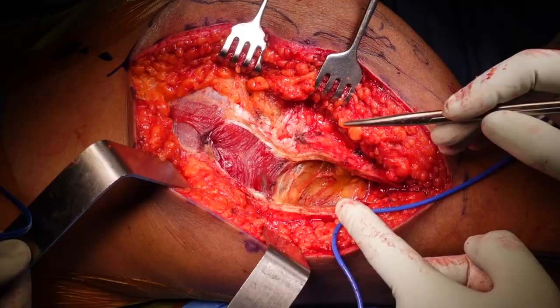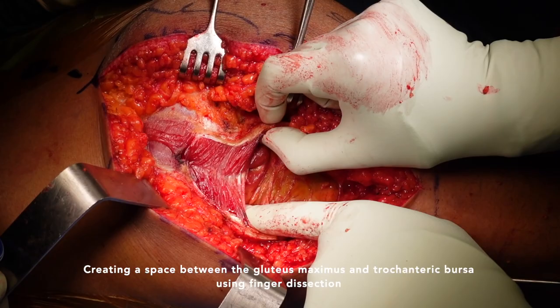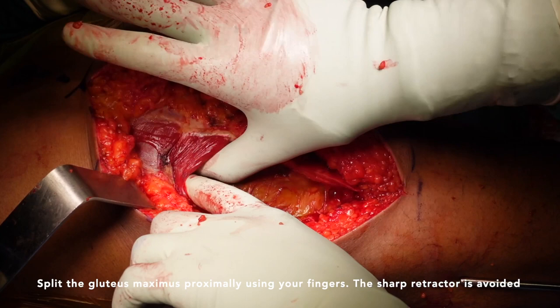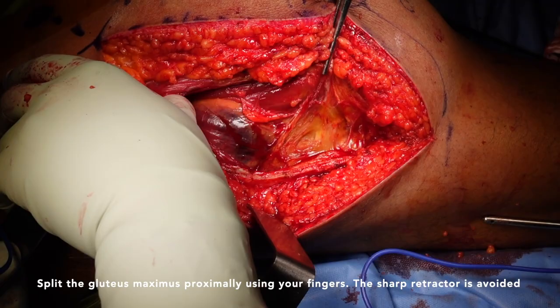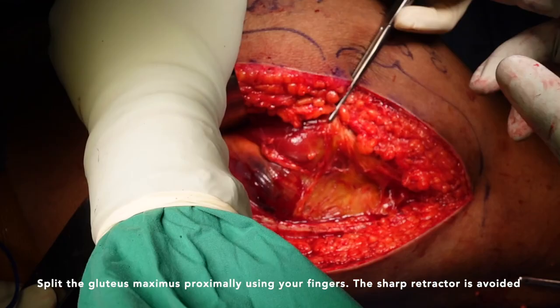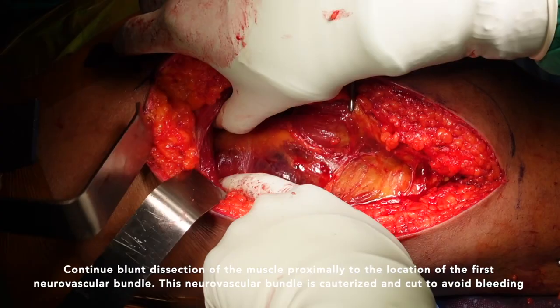Create a space between the gluteus maximus and trochanteric bursa using finger dissection. Split the gluteus maximus proximally using your fingers. The sharp retractor is avoided. Continue blunt dissection of the muscle proximally to the location of the first neurovascular bundle. This neurovascular bundle is cauterized and cut to avoid bleeding.